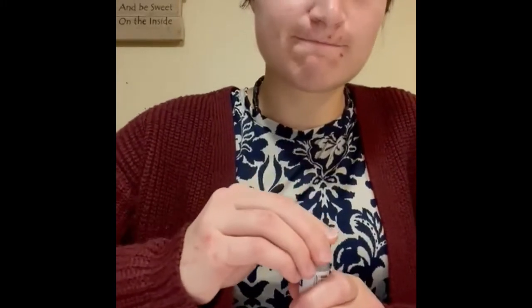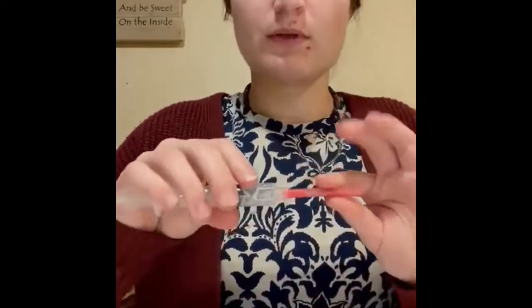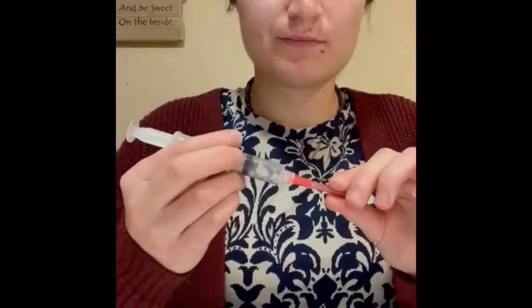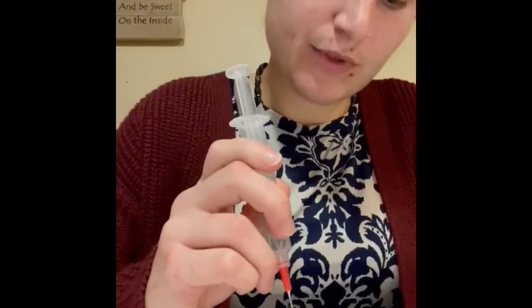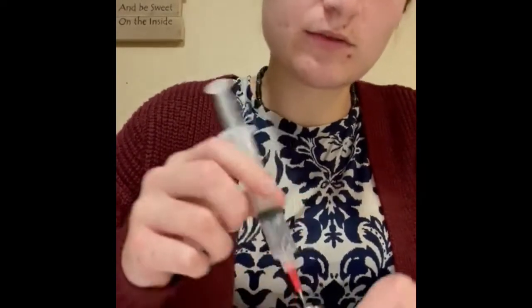So you want to draw 4 mLs of air. And then you would want to take the cap off and open a swab and swab the top. Let that dry. Then I'm going to put it into the center of the vial, keeping things sterile.